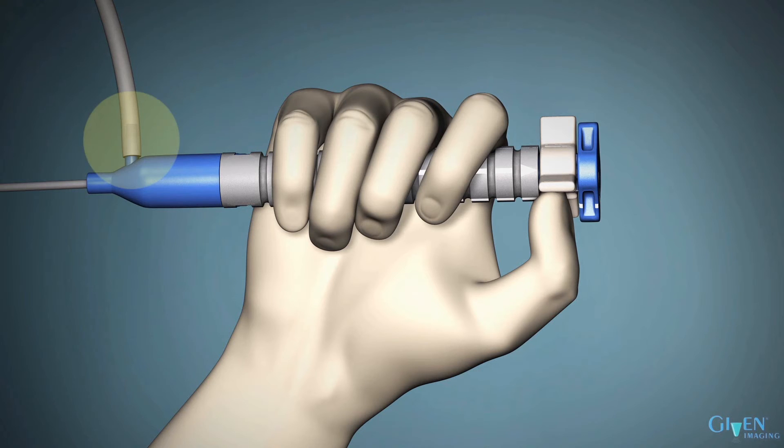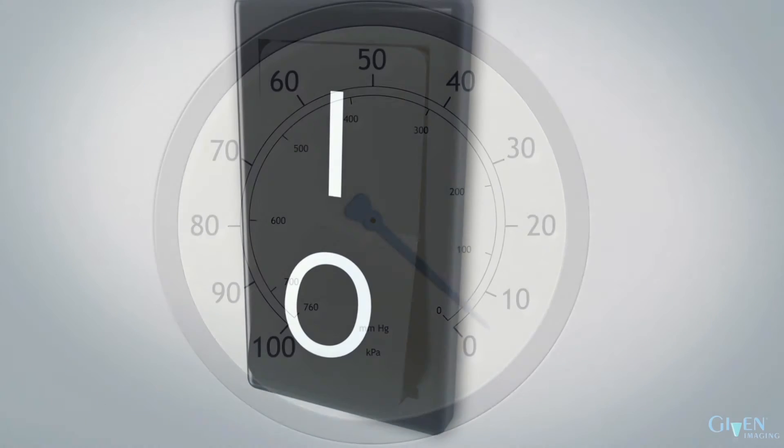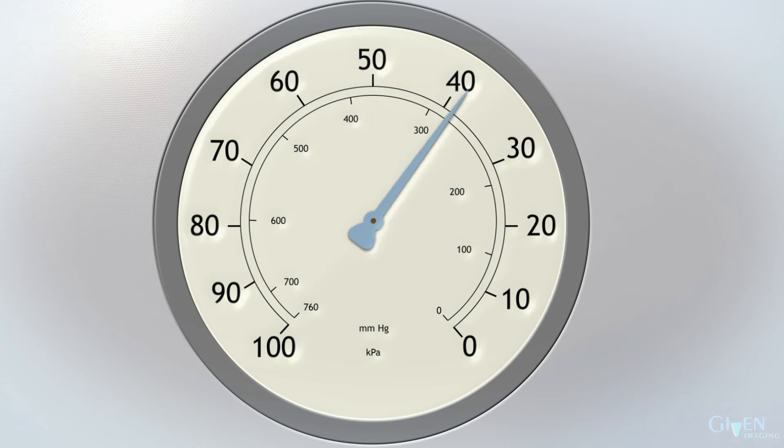Attach the vacuum source to the handle and make sure that the vacuum flow knob is turned to maximum. Turn on the vacuum and verify that the vacuum gauge reading is at least 550 mmHg.